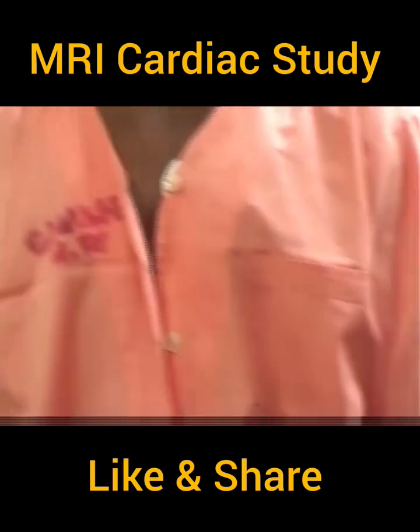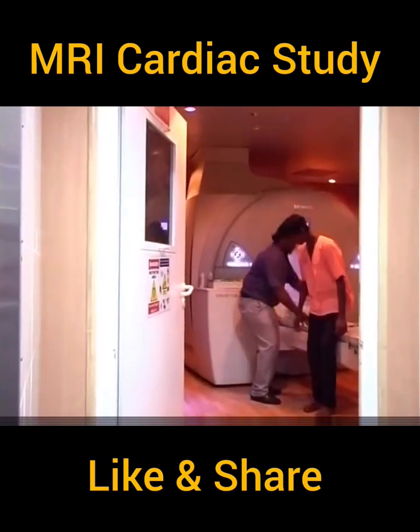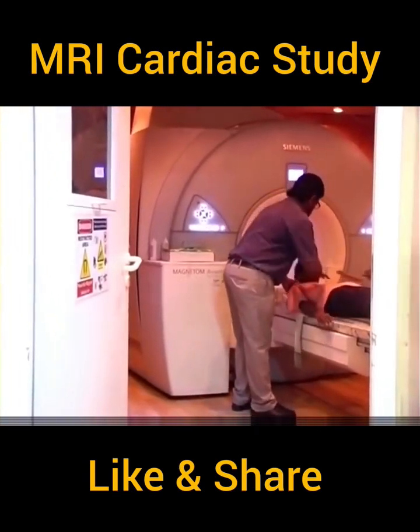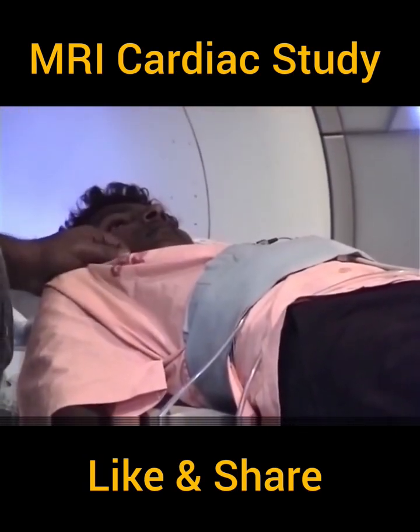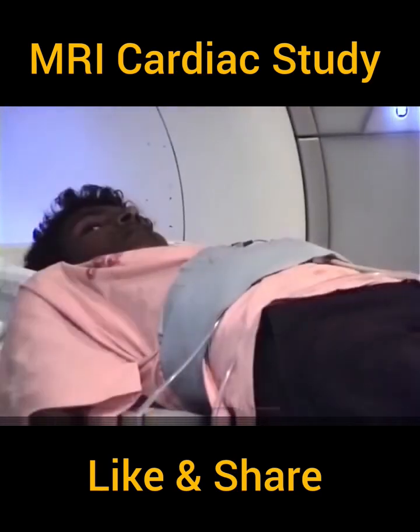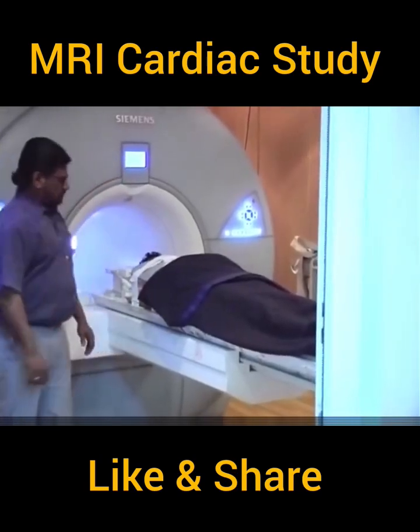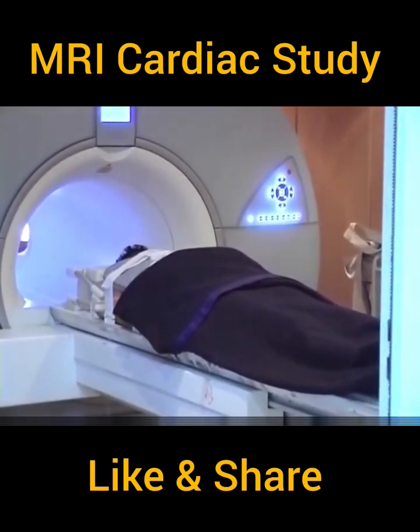The patient is entering the cardiac MR suite and is asked to lie down on the table. The ECG electrodes are connected to a Bluetooth device, and there is a respiratory bellow for respiratory monitoring. An 8-channel cardiac MR coil has been placed over his chest. The patient is covered with a blanket and is placed inside the gantry.